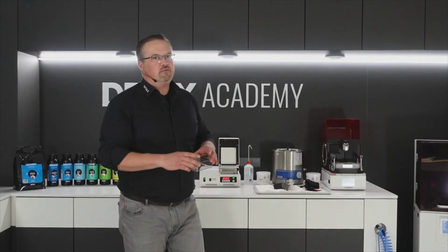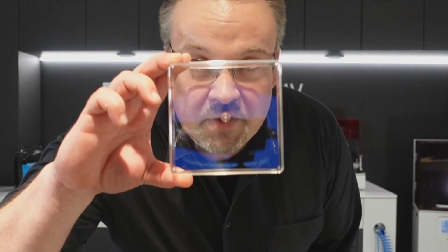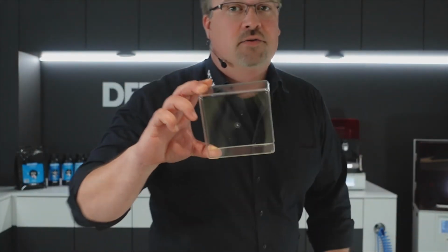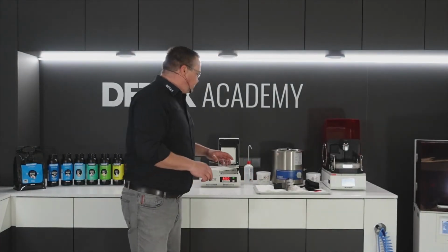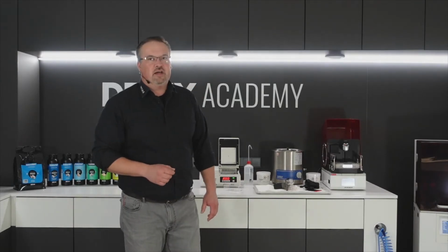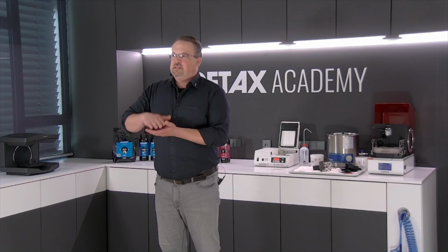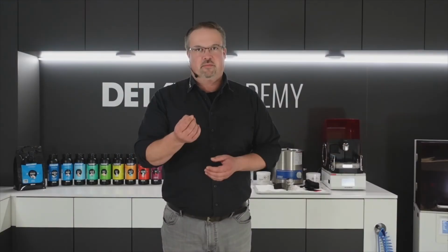And please do me a favor. This is a plastic box who is inside. And if you can see me, all it's fine. If you can't see me, it does not work. Why? It is totally easy. The objects need light for the final curing. That means if the light is not possible to go inside of the plastic box, you can't cure it finally, and after that you got a sticky surface sample.